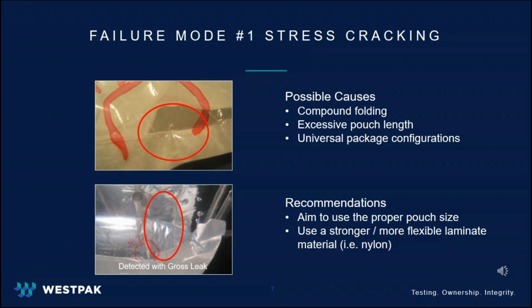The first failure mode is one of the most common. It is called stress cracking and sometimes more commonly known as flex cracking. The top photo shows an example of stress cracking. The bottom photo is how the failure appears during gross leak testing. The main cause of stress cracking is compound folding.